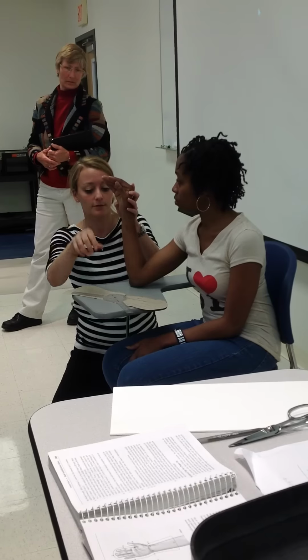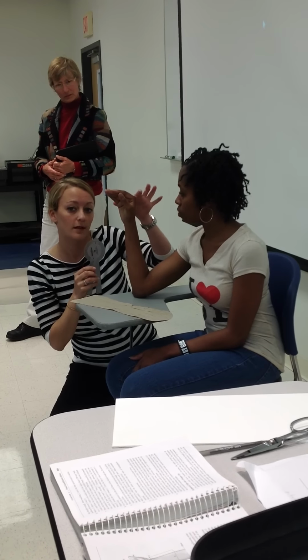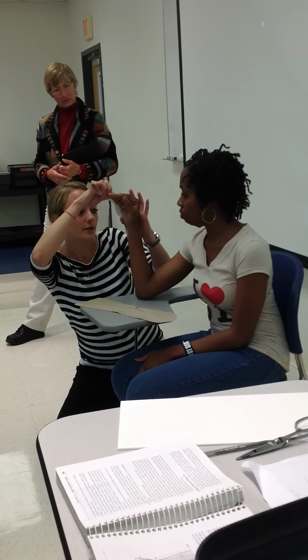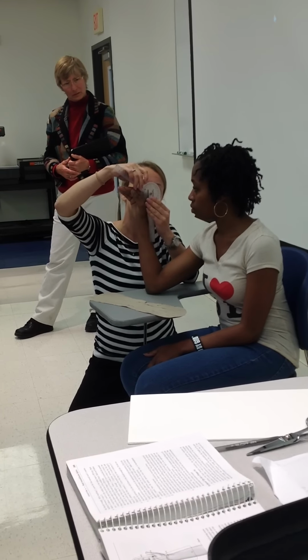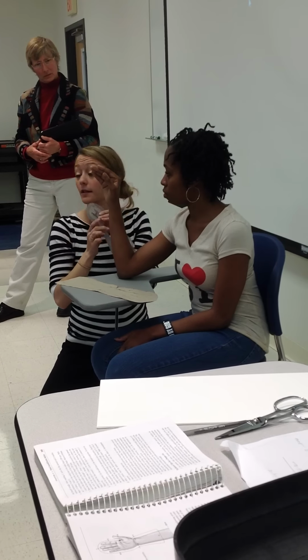So, and we're measuring the first and last, I think. The two outside ones. So you do your small. So there's 40 degrees. And then it's a little bit more than 40. About there. And then slide IP flexion.